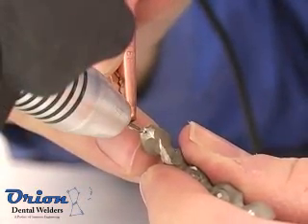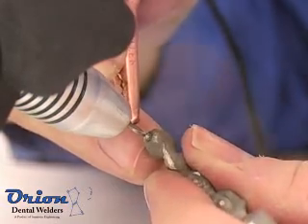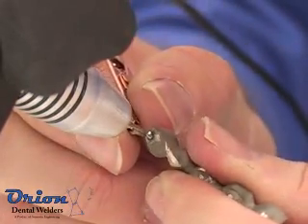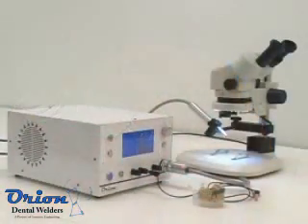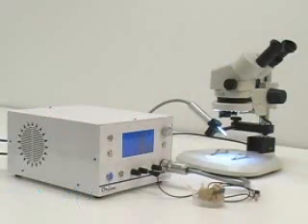The Orion welder is perfect for dental laboratories. It is intuitive to use and versatile enough to take on both big or small projects. The Orion can do the job of a laser welder and a spot welder, but with a truly affordable price tag.